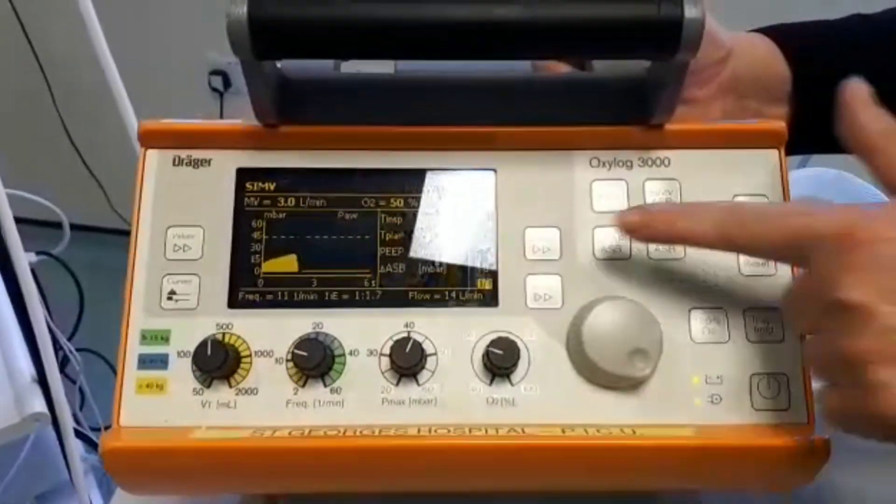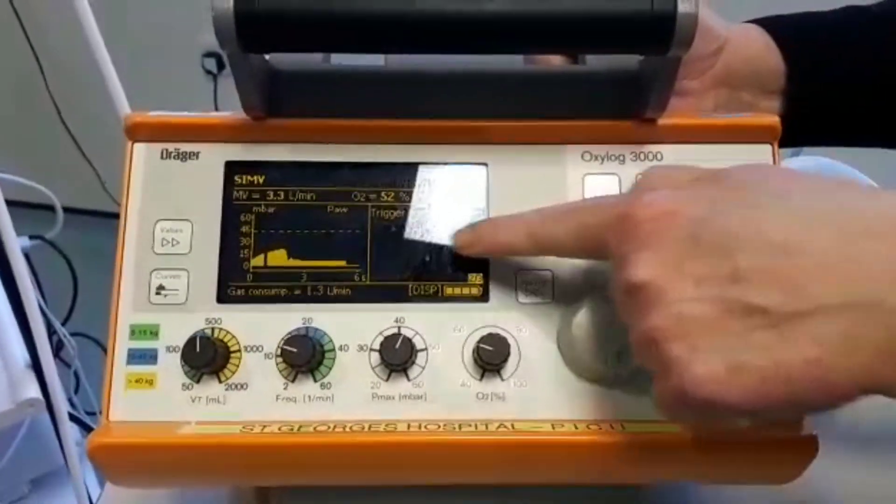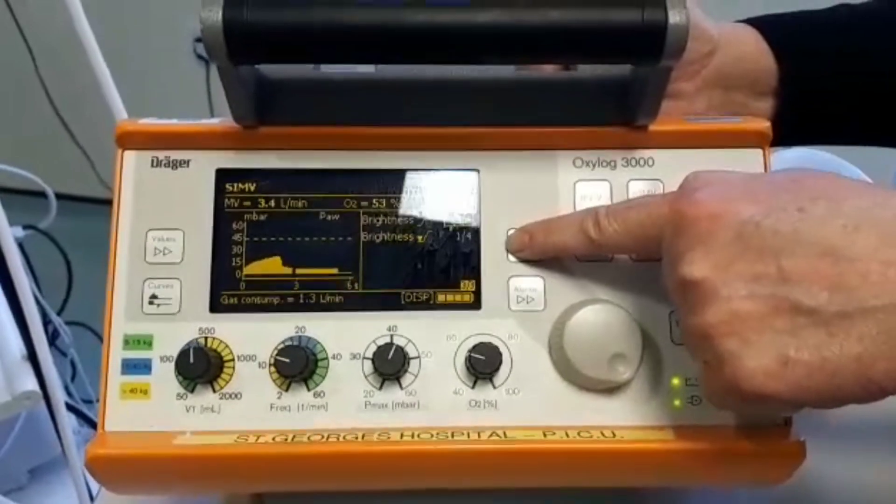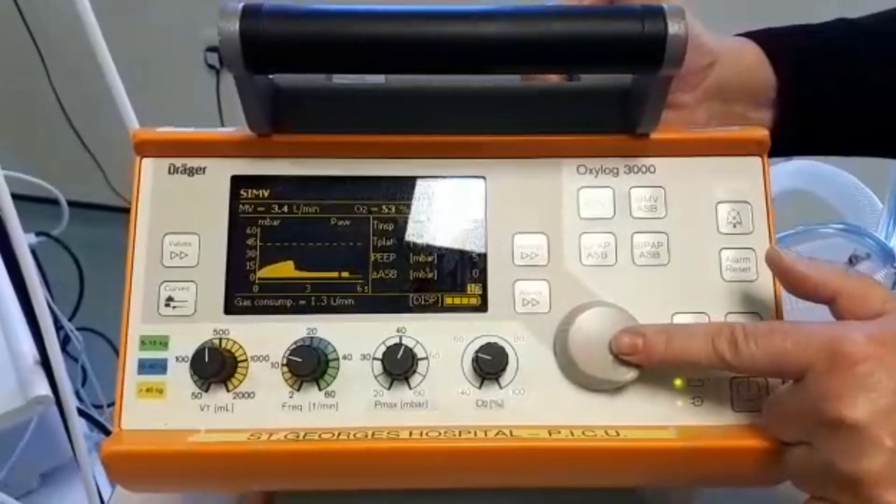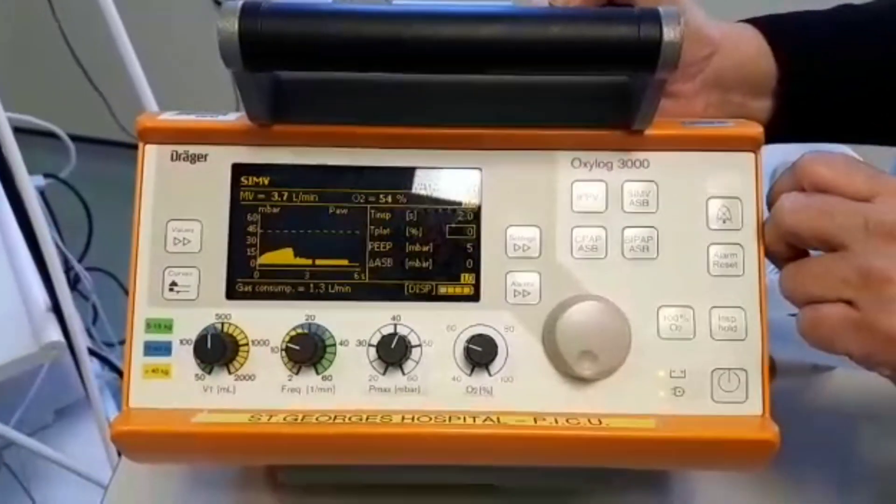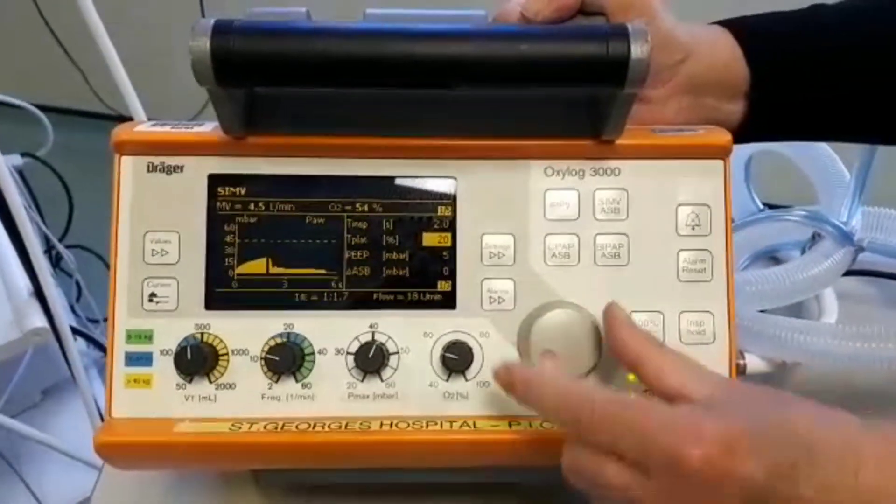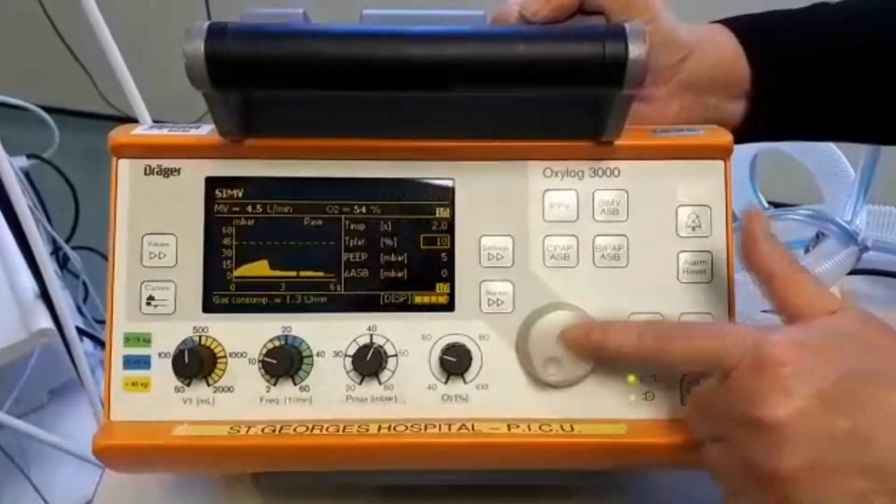For all other settings, we need to use the settings button which we press to scroll through different pages. And then we use the control knob to highlight the setting you wish to change. Confirm by pressing to enter, turn to adjust, and confirm by pressing again.